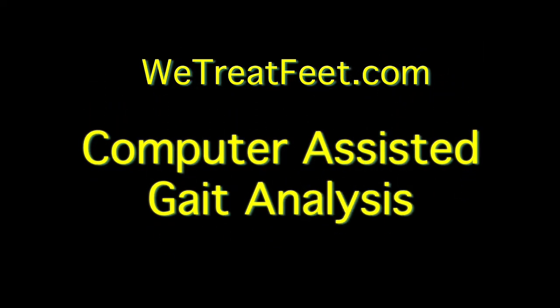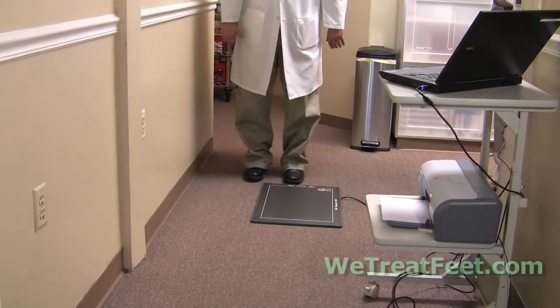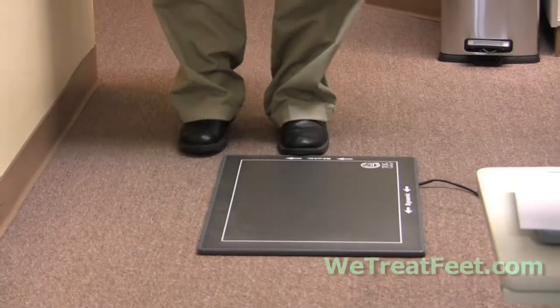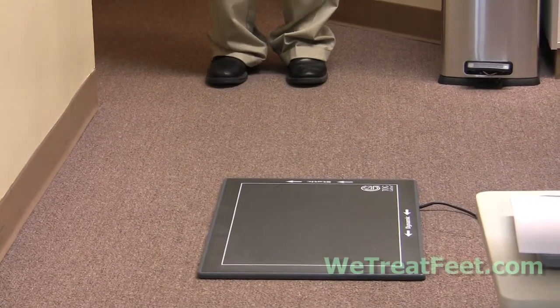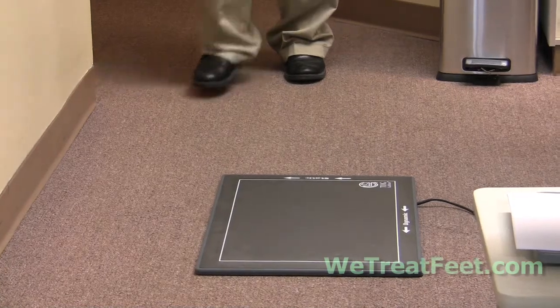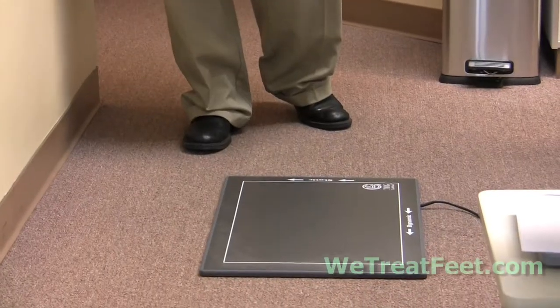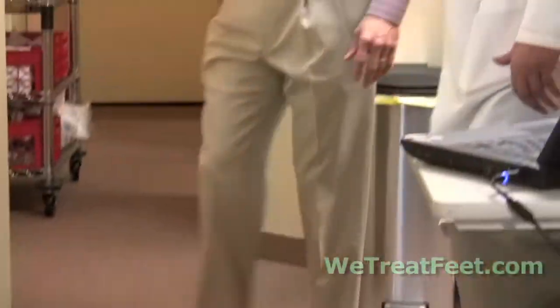When we scan, we scan one foot at a time. We normally scan the left foot first. So we line our left foot up with the arrow to the right of the word 'static.' We will take one step back, look straight ahead, and we walk over the mat. So we will lead with our right foot, hit with the left, and you'll continue walking for a few steps after that. I'm going to let you practice that a few times just to get comfortable.